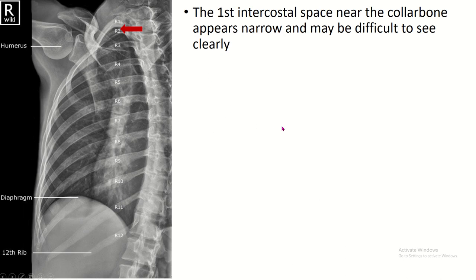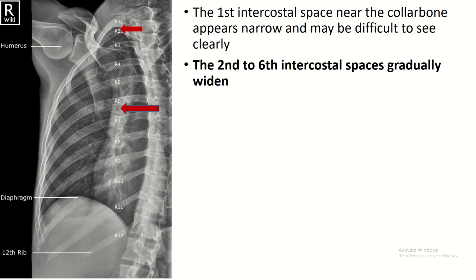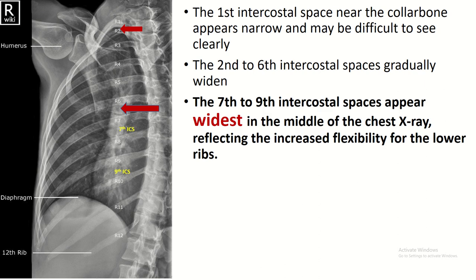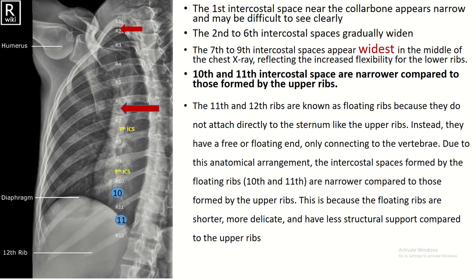On the chest X-ray, this is the first intercostal space. The 2nd to 6th intercostal spaces gradually widen. The 7th to 9th intercostal spaces appear widest in the middle of the chest X-ray. The 10th and 11th intercostal spaces are narrower compared to those formed by the upper ribs. The 11th and 12th ribs are known as floating ribs because they do not attach directly to the sternum like the upper ribs — instead they are free-floating and only connect to the vertebra.